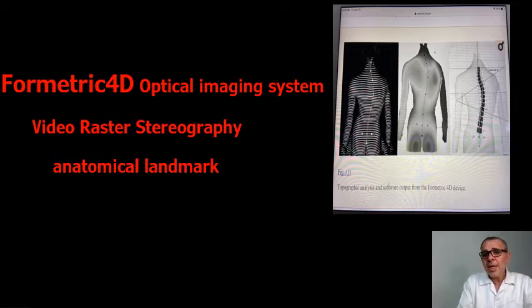What it does is make black and white striations, as you see here, externally, so it's non-invasive, cost-effective, and it uses anatomical landmarks.